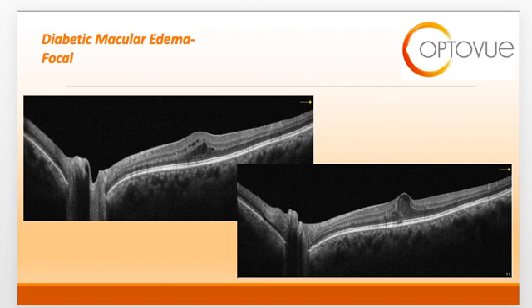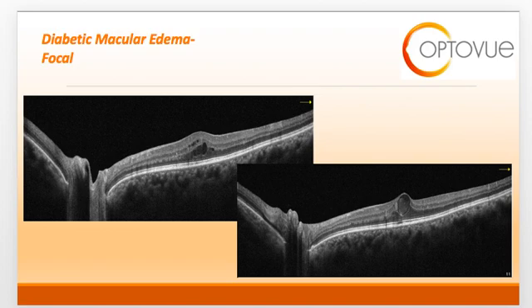The classic clinical descriptions of DME include focal, diffuse, and cystoid, or CME, and these we make based on clinical appearance. Focal leaking microaneurysms will lead to focal macular edema, which will appear as well-circumscribed areas of thickening on OCT. Oftentimes, you will see hard exudates adjacent to the area of focal edema. On these OCT scans, you can see the hyporeflective areas that are very focal in nature representing the diabetic macular edema.